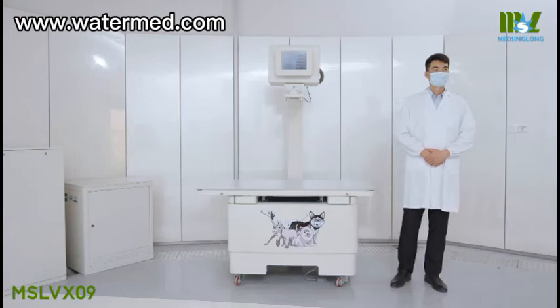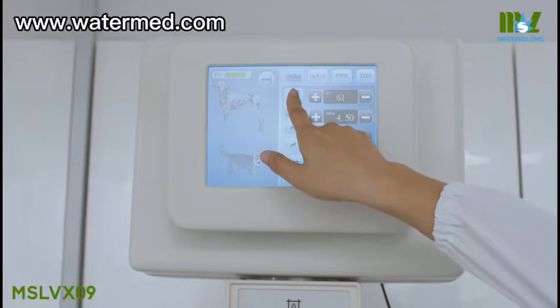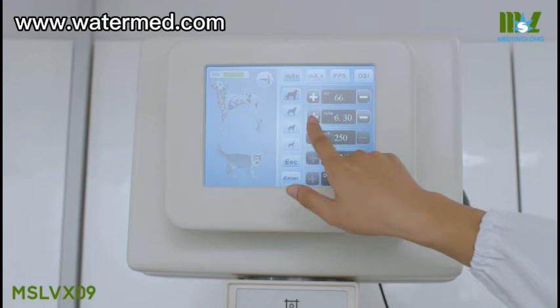On the animal graphics LCD touch screen, we can adjust the parameters for exposure of dogs or cats in the aspects of different body parts and sizes. We also have rich pre-programs for your reference — you can edit and store them according to your own needs.